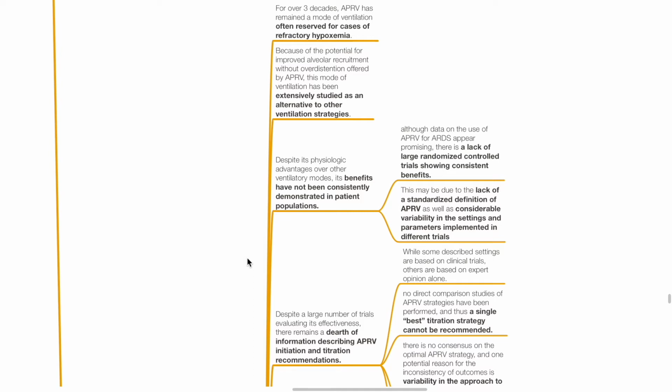Although data on the use of APRV for ARDS appears promising, there is a lack of large randomized controlled trials showing consistent benefits. This may be due to the lack of a standardized definition of APRV, as well as considerable variability in the settings and parameters implemented in different trials.